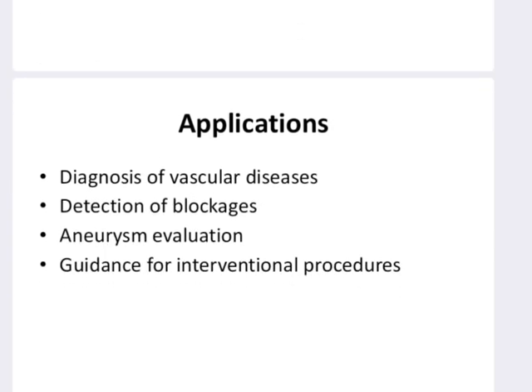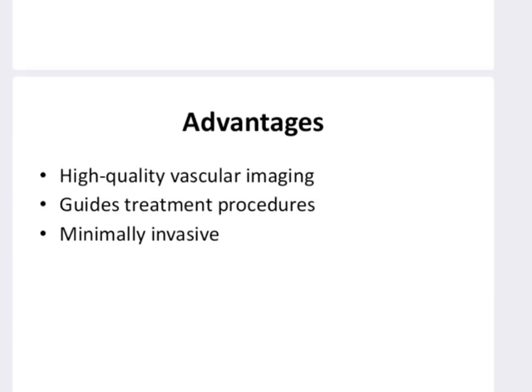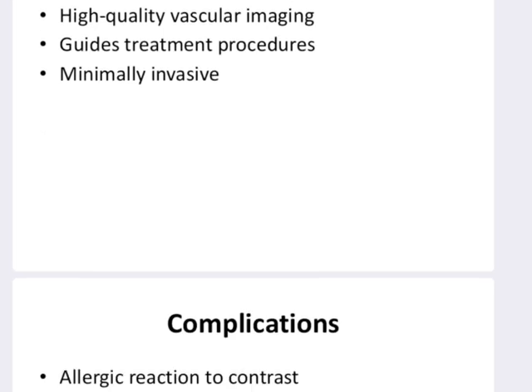The next is about the application. Usually this angiography will be applied in the cases of diagnosis of vascular diseases, detection of blockages, aneurysm evaluation, guidance for interventional procedures, etc. Then note the advantages. That is, it is high quality vascular imaging and it will be guiding the treatment procedures and it is usually a minimally invasive method.